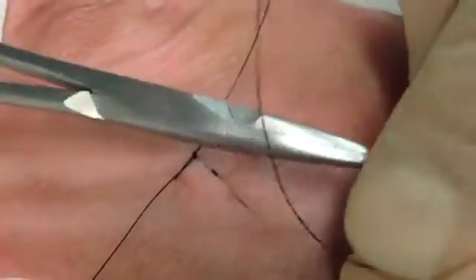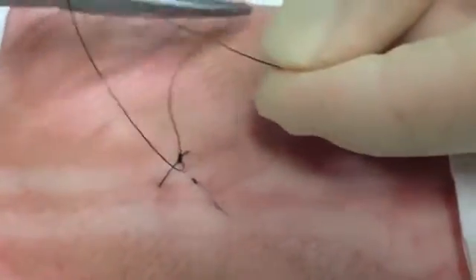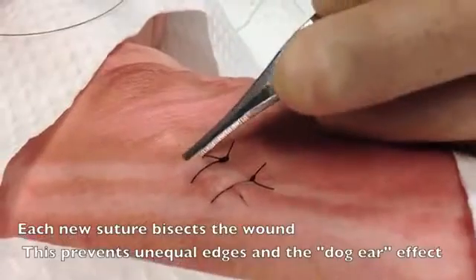And then we're going to come through on the inside again with another loop, grabbing that free edge and pulling through. Typically we use 3 knots for 3/0 nylon suture. Here you're seeing 4 knots for demonstration purposes. We'll pull the knots to the side of the wound edge and then clip the edges, leaving equal length tails.